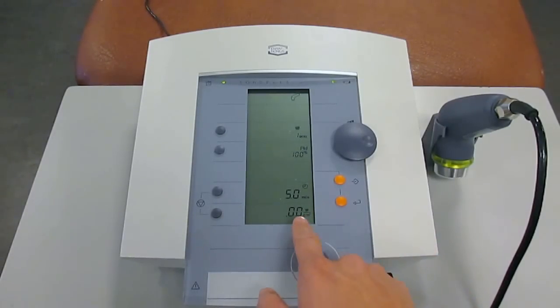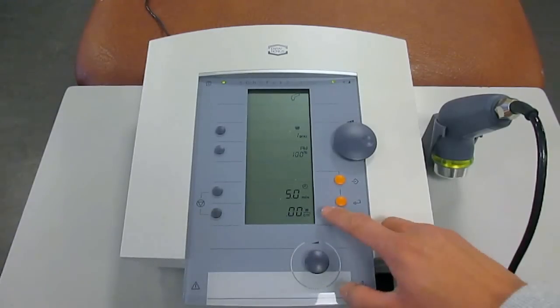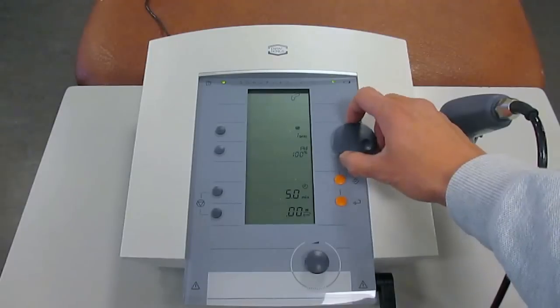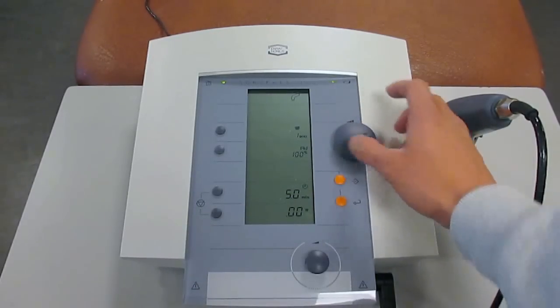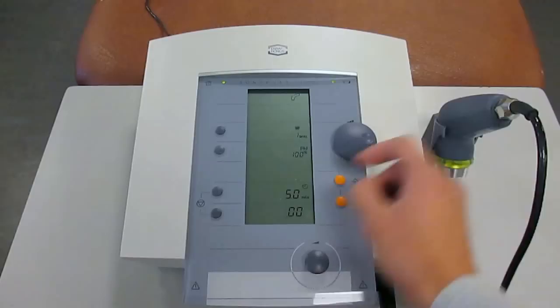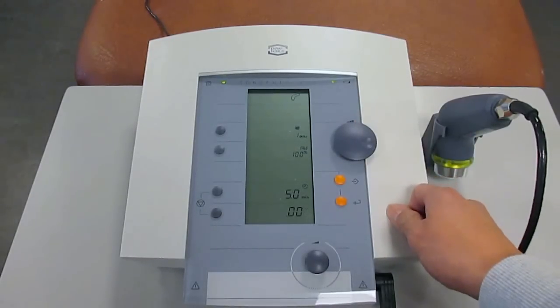For the ultrasound intensity setting, there are two units of measurement that you can use. One is the commonly used watts per centimeter squared, and that is recommended for treatment because it's much more controllable. However, there is an option for you to change that into just simply watts. For us, we would want to choose watts per centimeter squared.